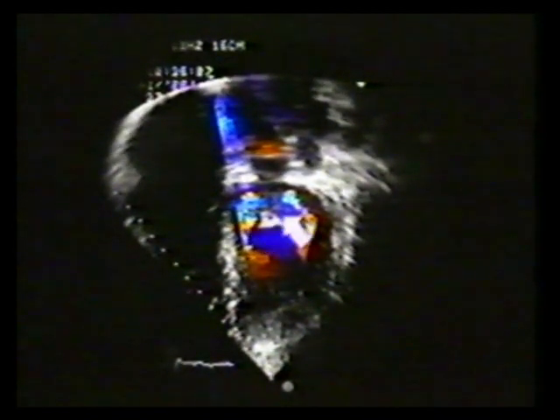Returning to the 2D exam, we will demonstrate normal color flow imaging for a mitral Starr-Edwards prosthesis. Blood from the left atrium enters the left ventricle around the ball in the form of a jet or spray. In 2 dimensions, this spray has the appearance of a pair of horns surrounding the ball. Note that there is no evidence of mitral regurgitation.